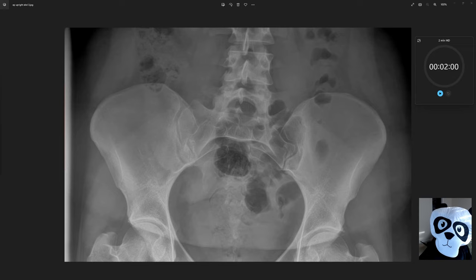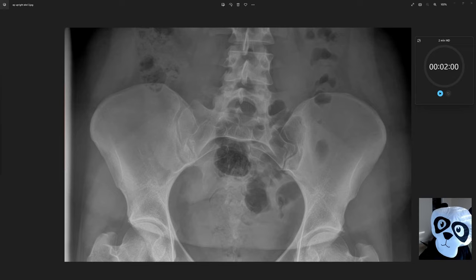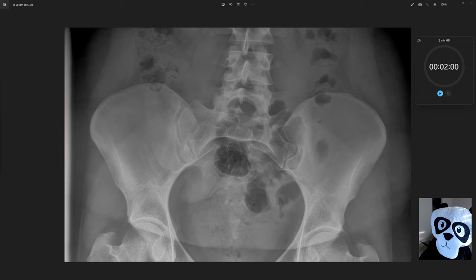Today we will be picking up where we left off with abdominal x-ray in five minutes. If you haven't seen part one, make sure you go back and watch that video first. Let's go ahead and start our timer.